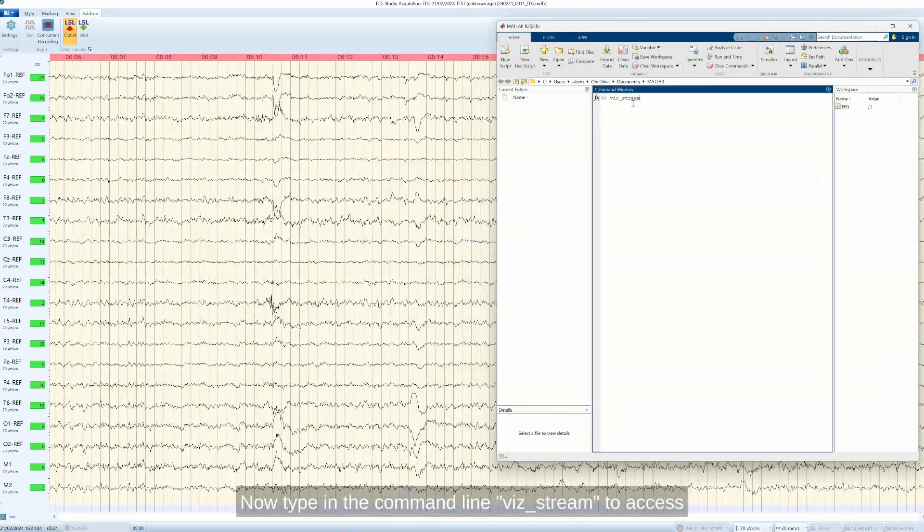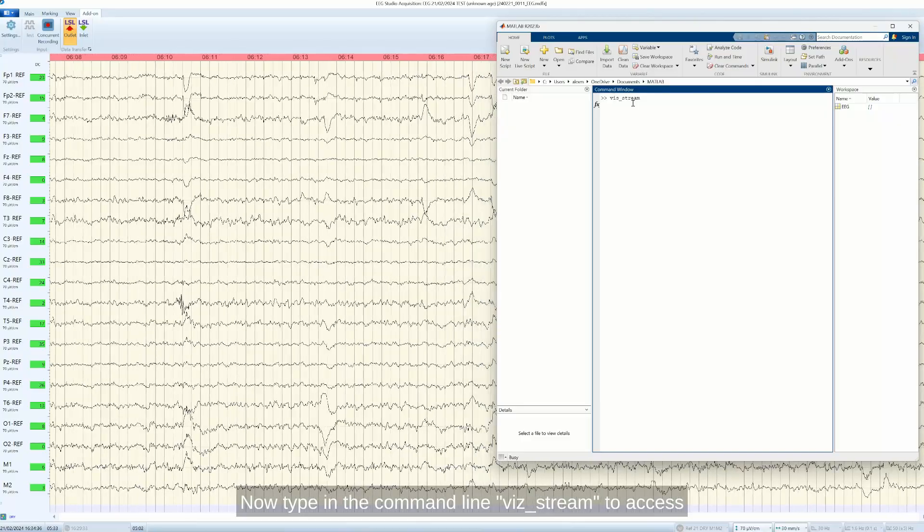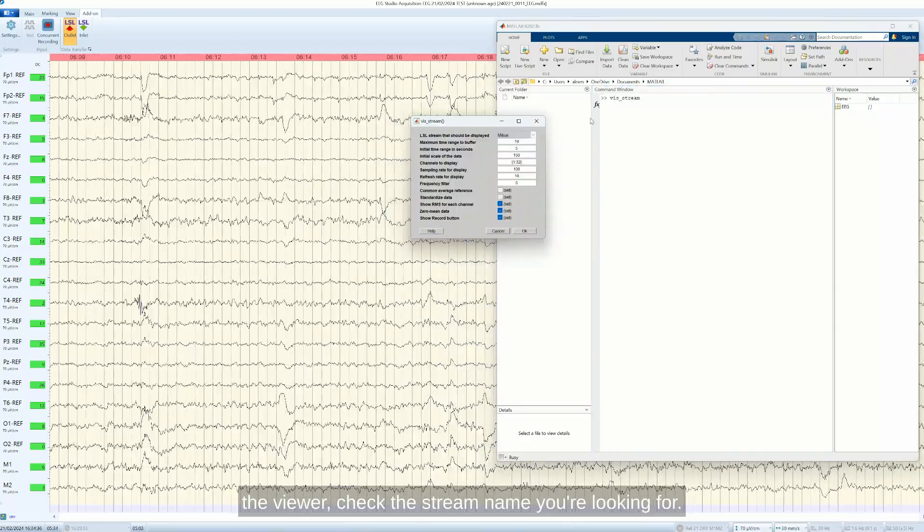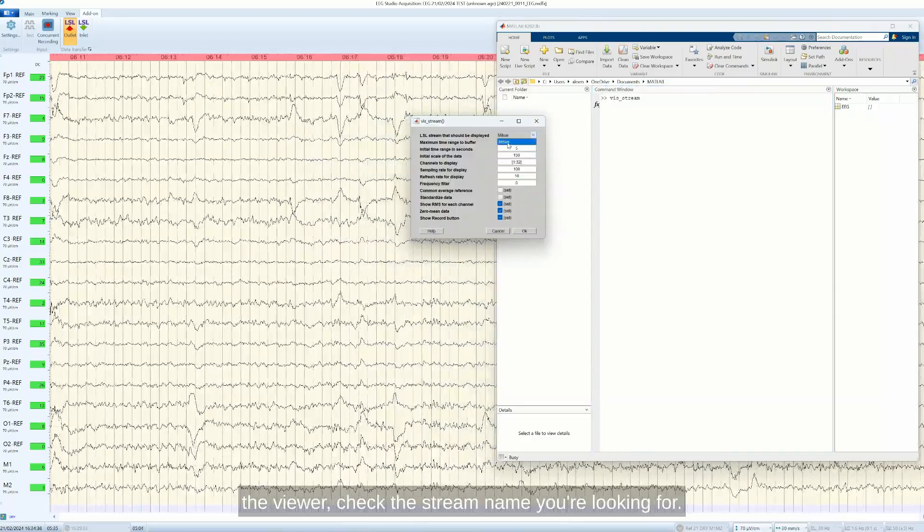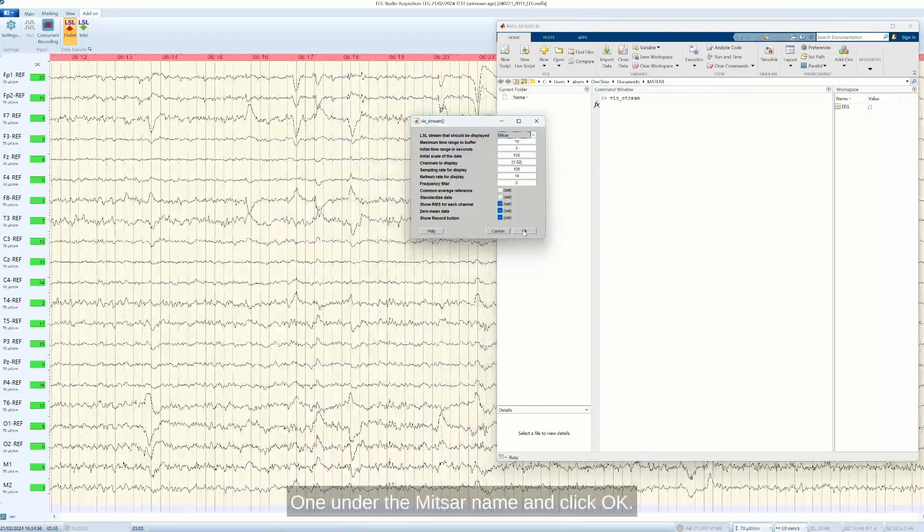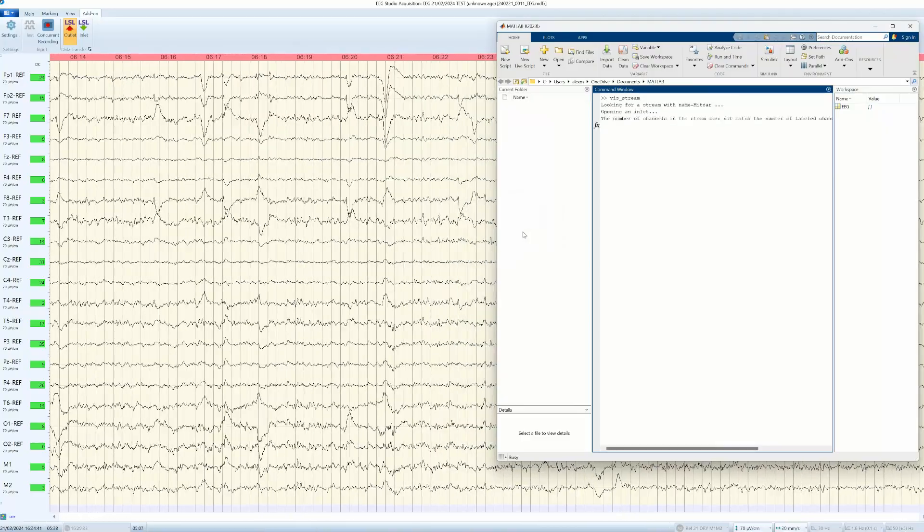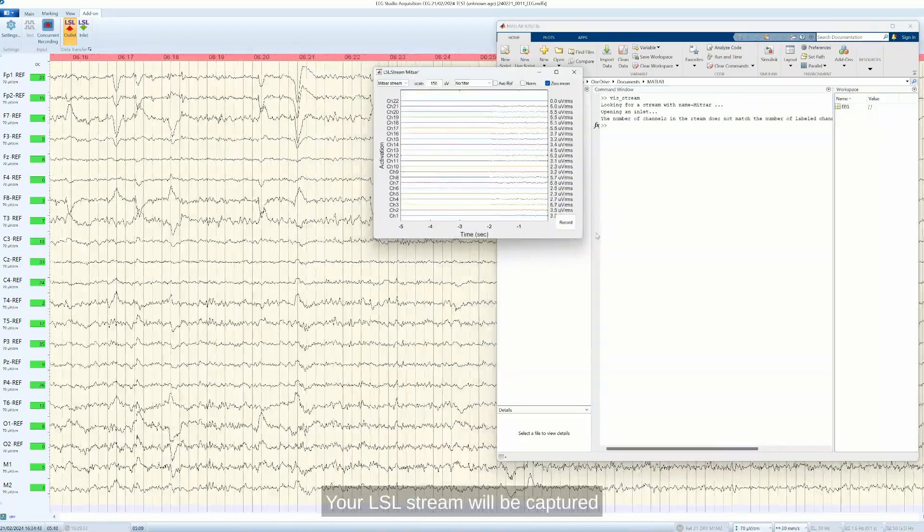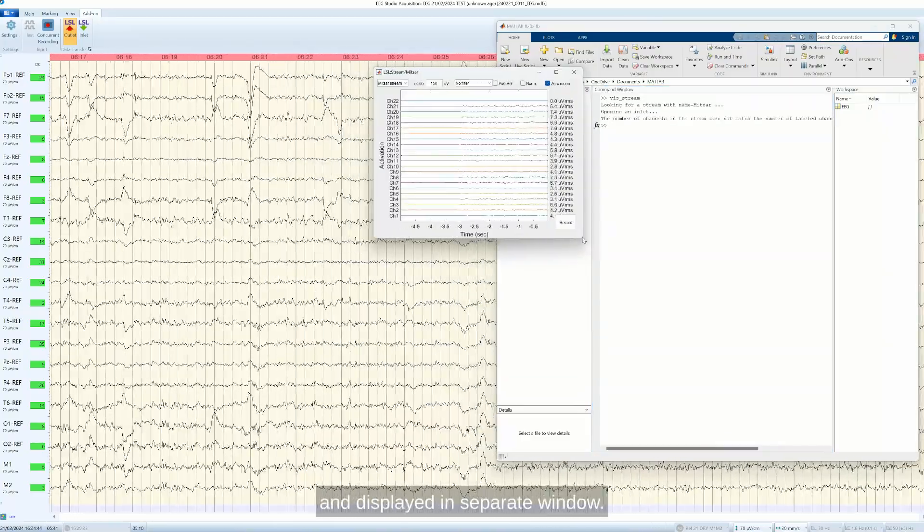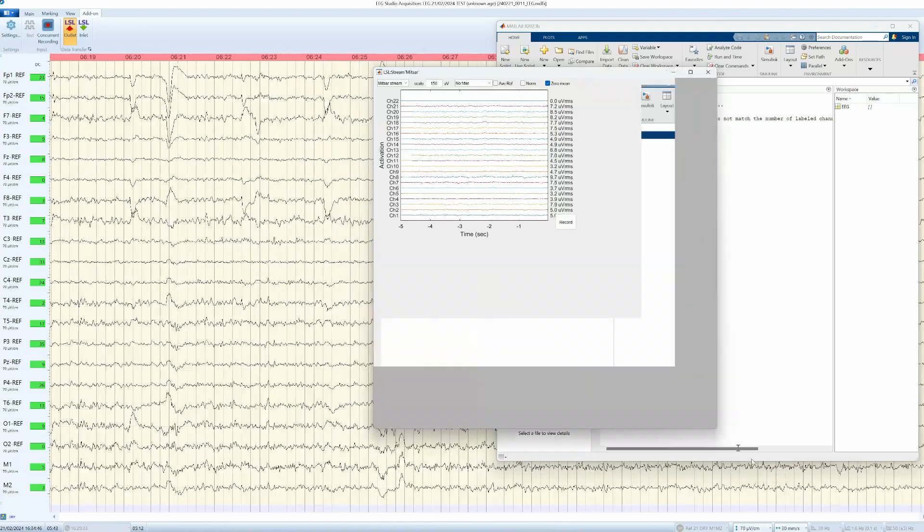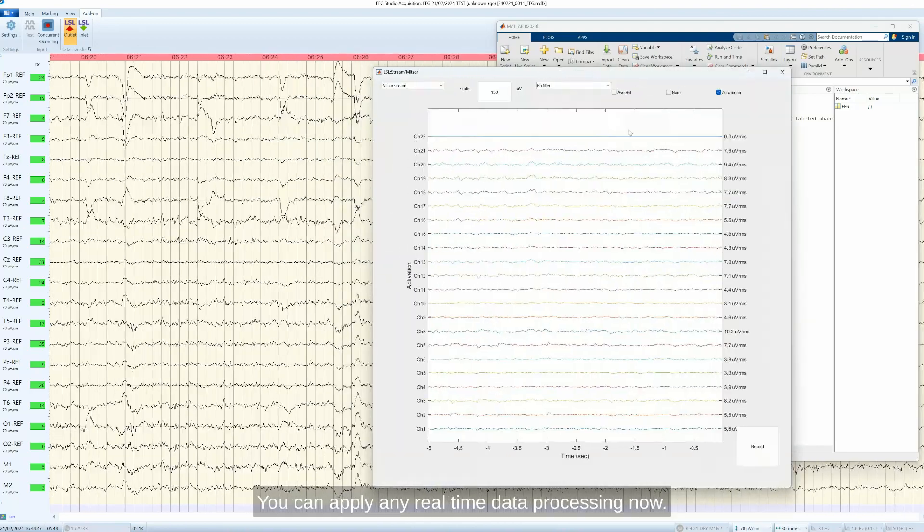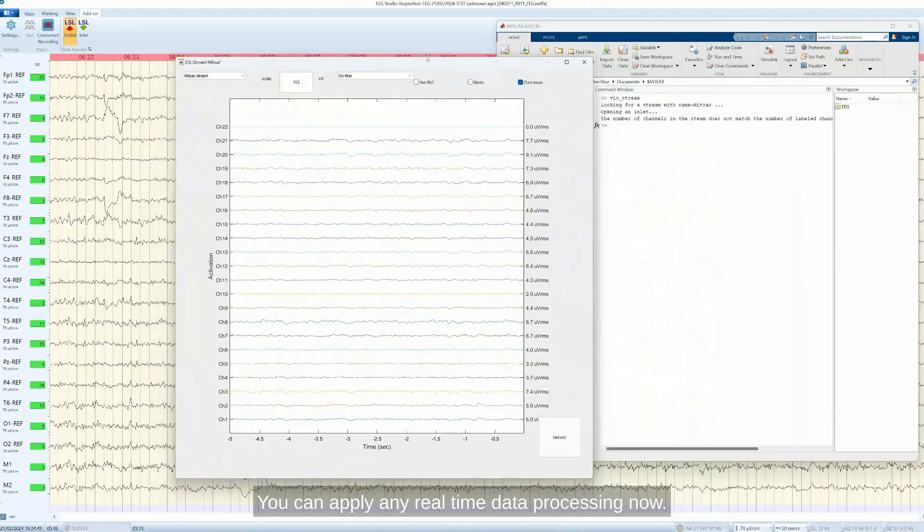Now type in the command line viz stream to access the viewer. Check the stream name. You're looking for one under the MITSAR name and click OK. Your LSL stream will be captured and displayed in separate window. You can apply any real-time data processing now.